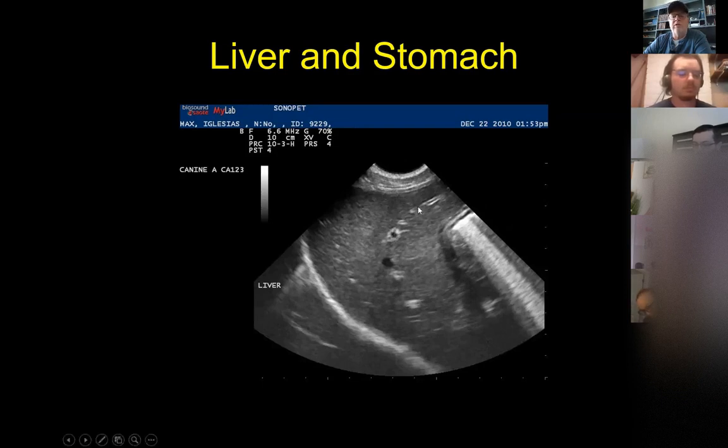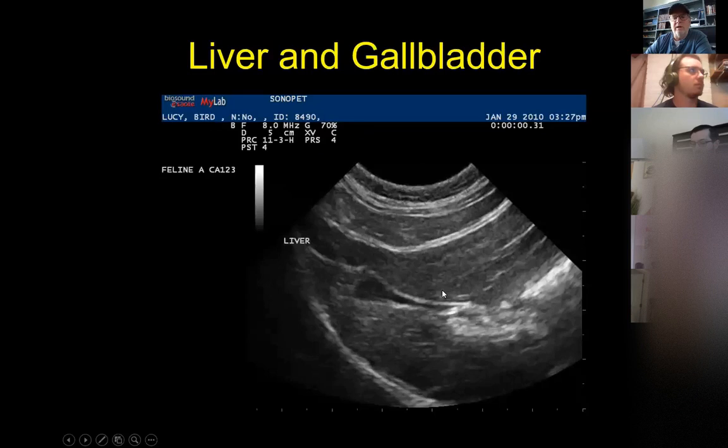So I look at these vessels inside the liver. There's prominent vessels here. There's one kind of end on coming right out at you in the screen, and this one here. Here's another vessel. This one has a white wall, that's kind of fun. This one doesn't. Okay, so there's prominent vessels inside the liver that I can see periodically throughout the liver.